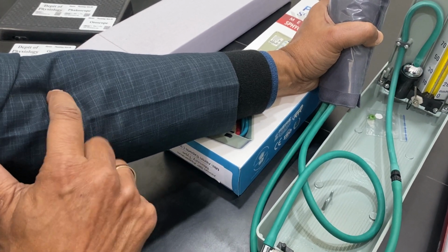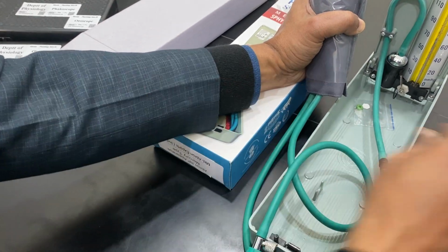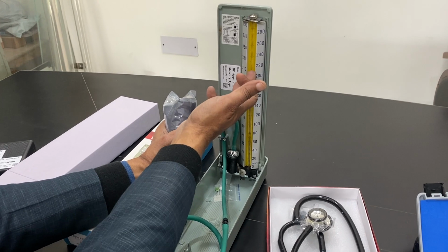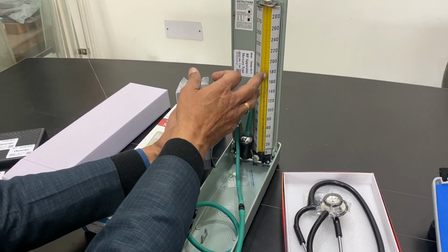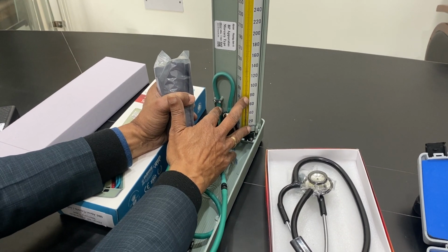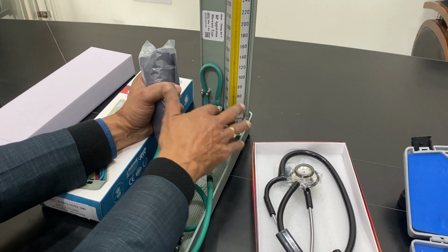There is a pulse feeling. You can feel the pulse with 3 fingers. Wherever there is a pulse, you can put the stethoscope there and push this, and when this goes to about 240, the sound will stop, the heartbeat will stop in the ears, and then slowly it will start, and then again as it comes down, say at 80, it will stop the heartbeat. You will not be able to hear it.